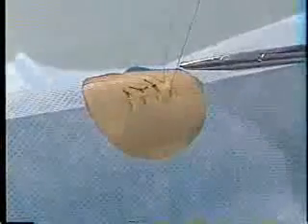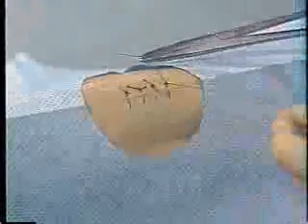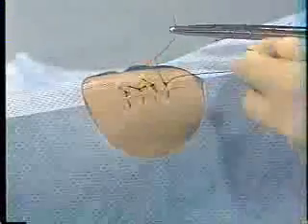Then tie on the side of the wound that you started on. Notice how this everts the skin edges so that they don't cave in. This technique is especially useful for deeper wounds in which you fear there will be dead space.